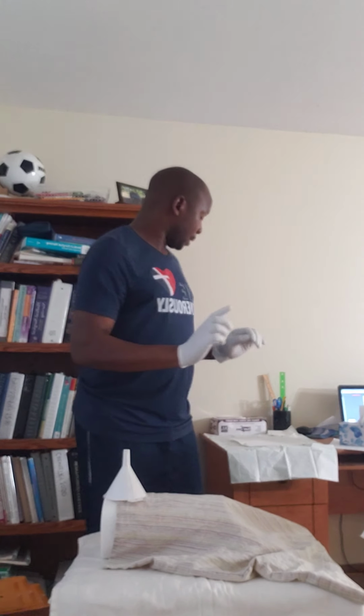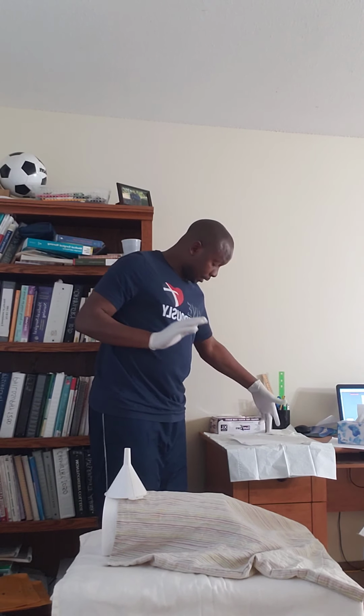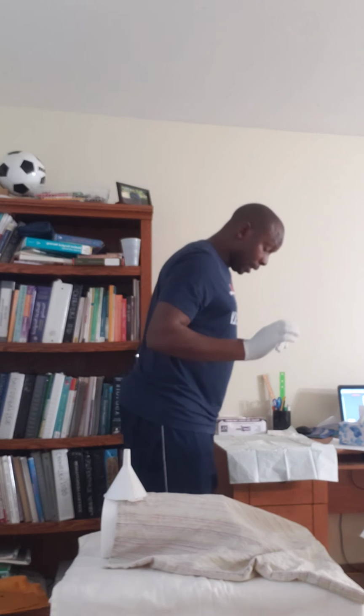Now I'm sterile. My gloves are sterile. Now I'll keep my stuff. If I have anything, I can touch in the middle here. If I don't want it, then I throw it away. I don't care, you see? Because that's when I need my area to stay sterile. At the end of the procedure, I can take out everything. I'm going to keep these hands above my waist.